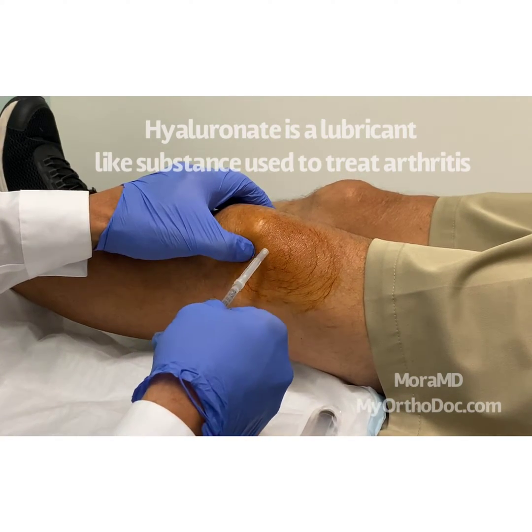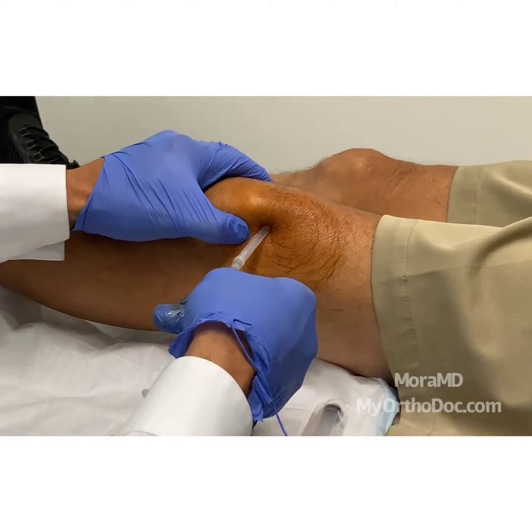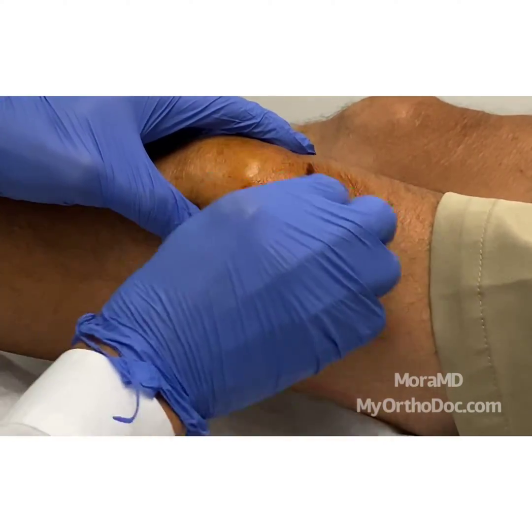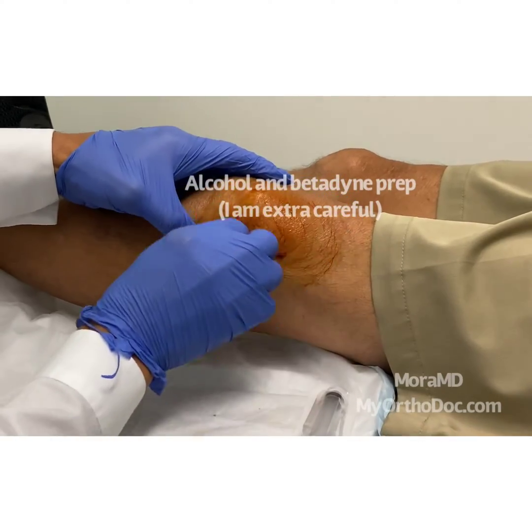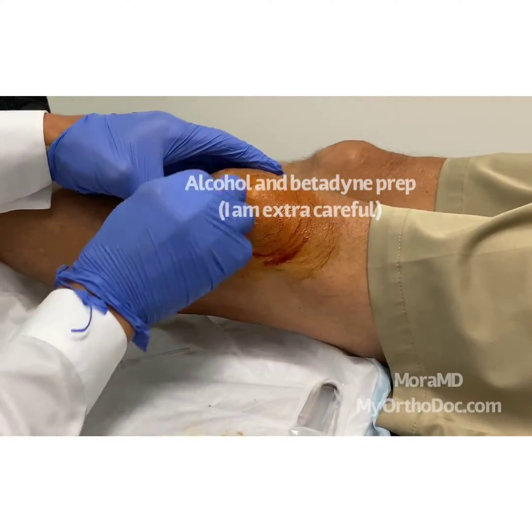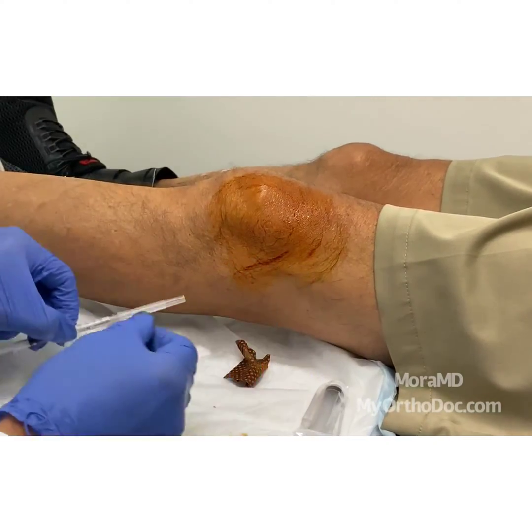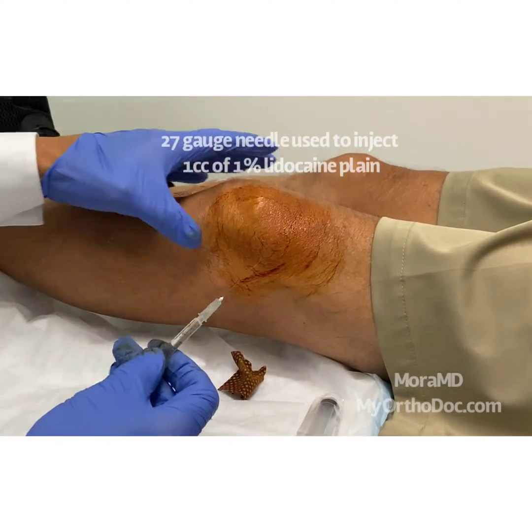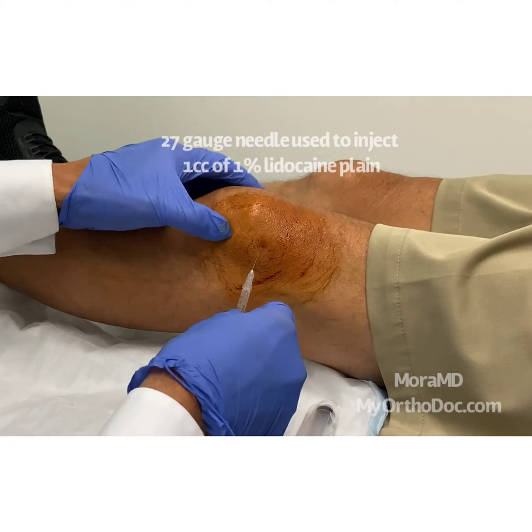We're going to go into the patellofemoral joint. I use this to mark it — if you make a mark like that, the mark doesn't come off the way a pen mark with ink would. So the first thing we're going to do before we inject Orthovisc, which is what we're injecting for arthritis, is aspirate the effusion. There's my mark right there — little poke, good.